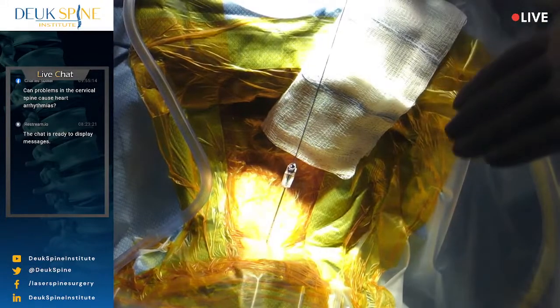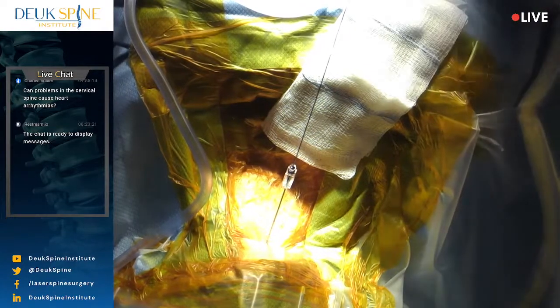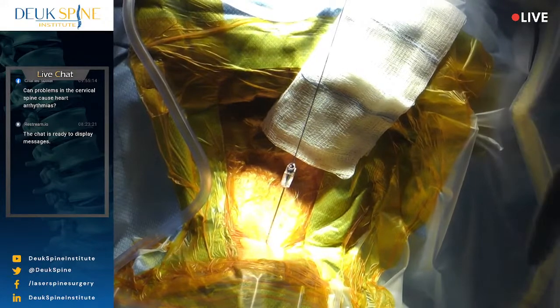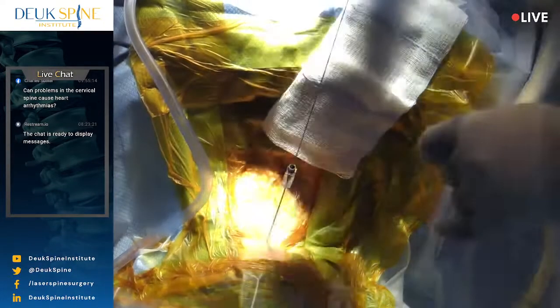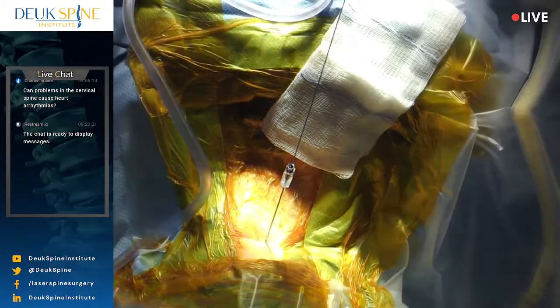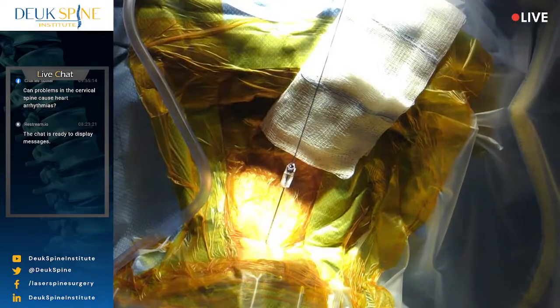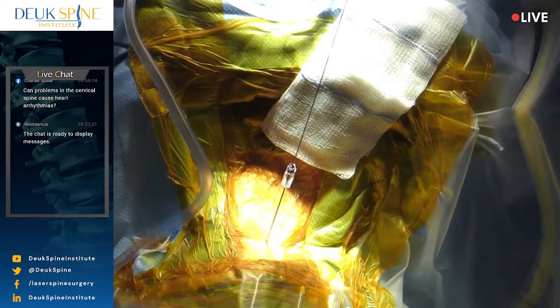You see how I push through the soft tissues, the strap muscles, everything gets displaced. So if he's gagging and tightening up, I can't feel the spine properly. That's why they need chemical relaxation. My point is that normally I place 2 needles in the beginning while they're soft and supple, but now we're gonna do one and then I'm gonna go to the other one in about 20 minutes, which means I need relaxation about 15, 20 minutes. So just letting you know.